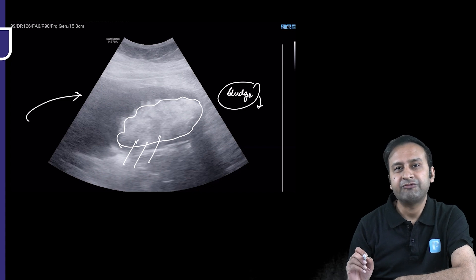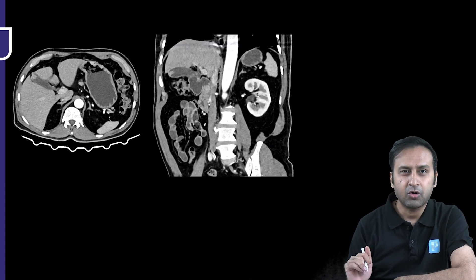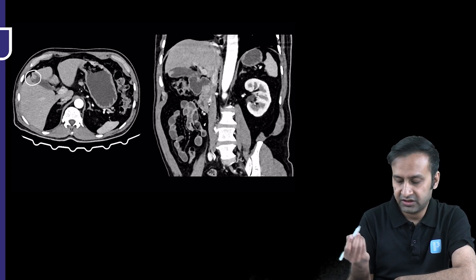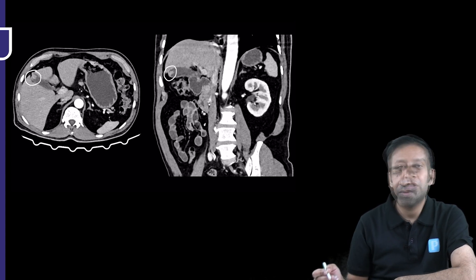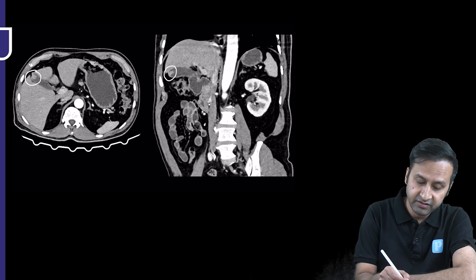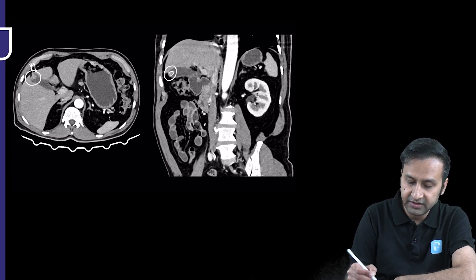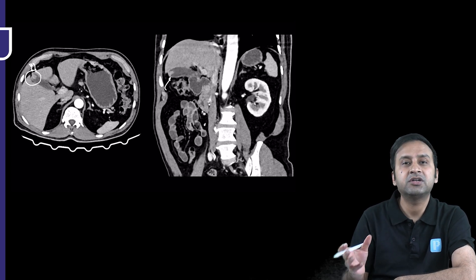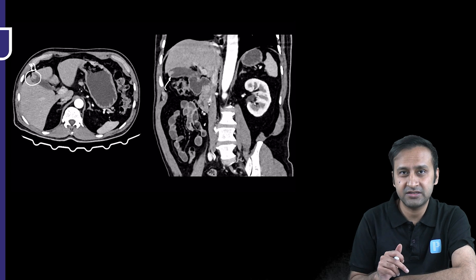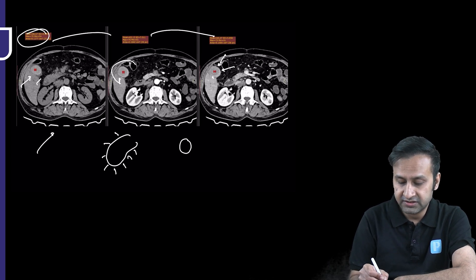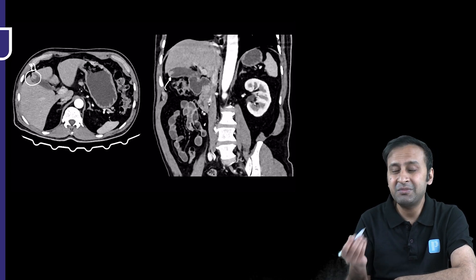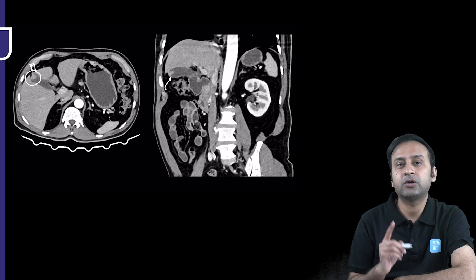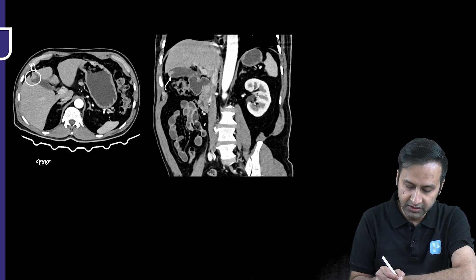This was a dicey, confusing case on pure CT, but ultrasound helped solve it very easily. Next case: what is this pathology? You can see an intraluminal hyperdensity or intraluminal nodularity within the fundus of the gallbladder. Is it a stone? No, it is not a stone. It is actually an enhancing polyp attached to the wall of the gallbladder, and the easiest way to confirm is to compare with the non-contrast scan.